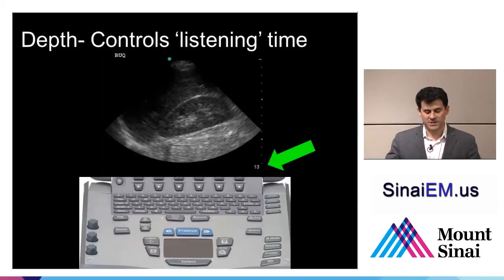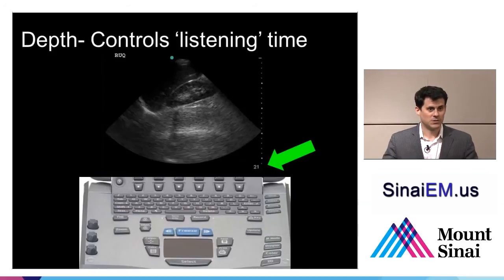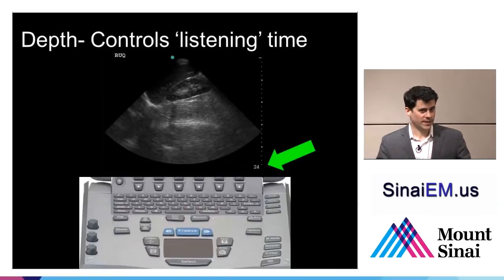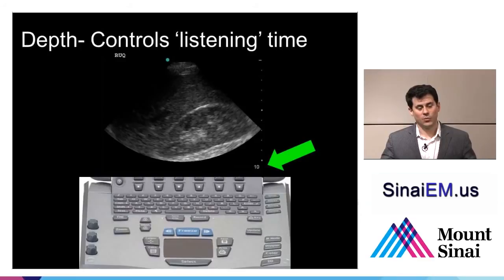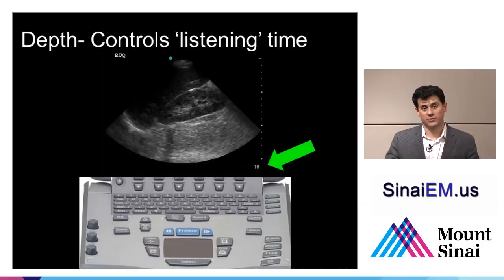The idea is that you want to see nice big structures for what you care about visualizing, and you don't want to waste any screen real estate on empty space. So don't get zoomed in too close, or you'll lose your perspective on what you're looking at. And if you're too far away, you're wasting a lot of ultrasound energy on imaging structures that don't give you any information, and you're not getting as big of a picture as you could, giving you as much detail.